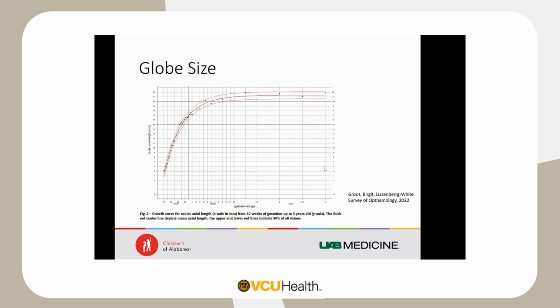is the optic nerve sheath diameter better described per patient, based on these other measurements, rather than a range, a normative range?